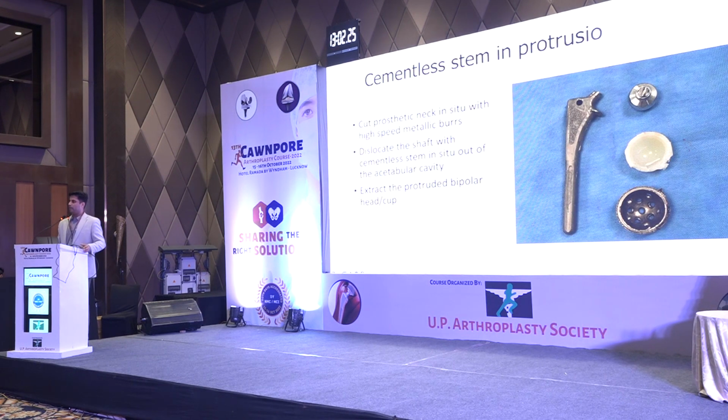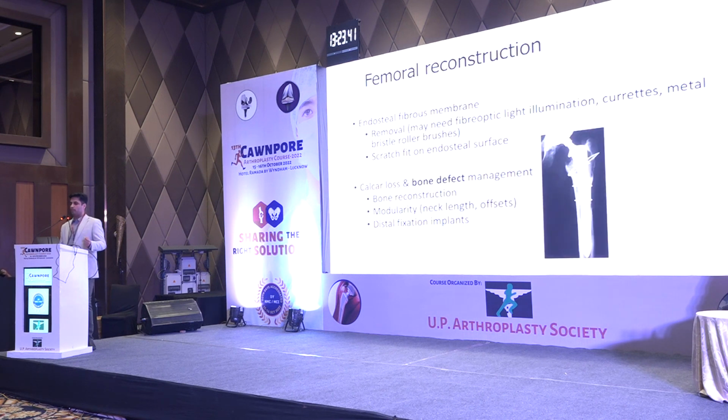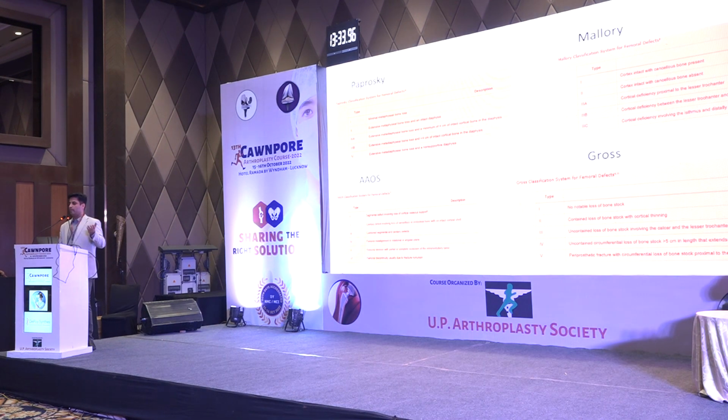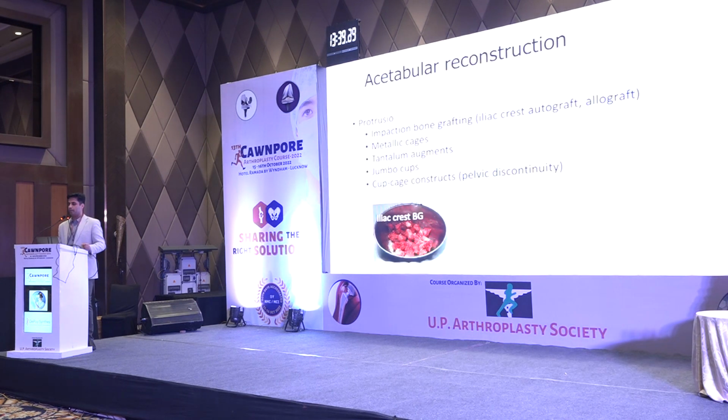That's all. And sometimes, especially in the bipolar systems where the head locks inside the plastic of the bipolar, you really can't dislocate it. Sometimes you may actually use metal burrs to cut off the metallic neck to dislocate the head. The femoral reconstruction then becomes easy. Once you have removed all of the cement and all the implant, then only can you do reconstruction, and the defects are identified after the extraction of the implant. So you classify them, whether on Paprosky, AAOS, Mallory, or Gross, but predominantly the Paprosky classification, after you've removed the stem and the implant.